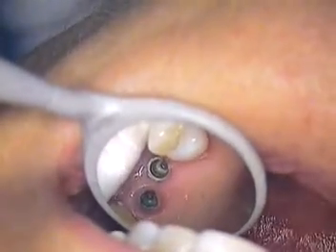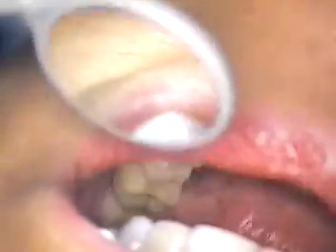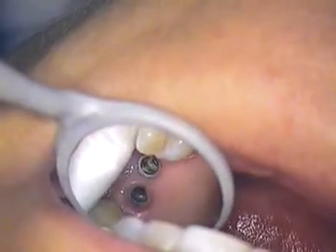Cotton roll goes back in. Now what we need to do is put just a drop of tartar and stain — that goes in there, and it has to be closed up a little bit. So we'll put some in there if she can lay back like that. We'll do a little tartar and stain, leave it in place, let it soak, and get the threads clean internally, because they're internal hex.